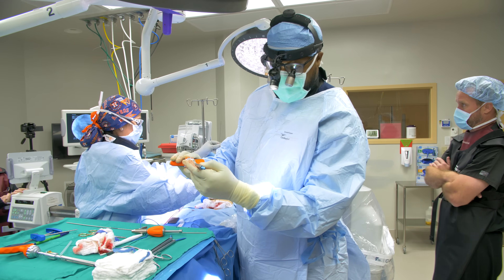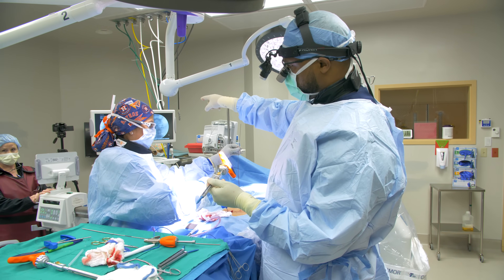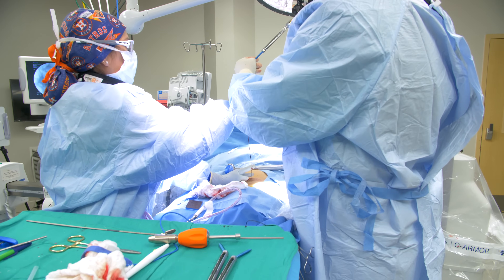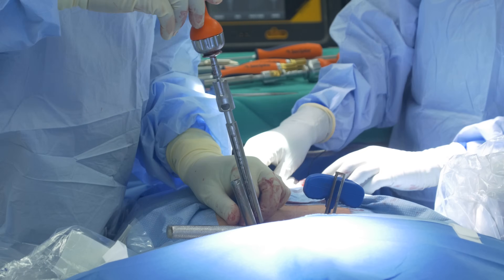This is a pedicle screw going into the spine. We have our K-wire — that little black line — and the screw is going right over that K-wire into the pedicle. This will help fuse the level, and we'll place a rod over it to stabilize things.